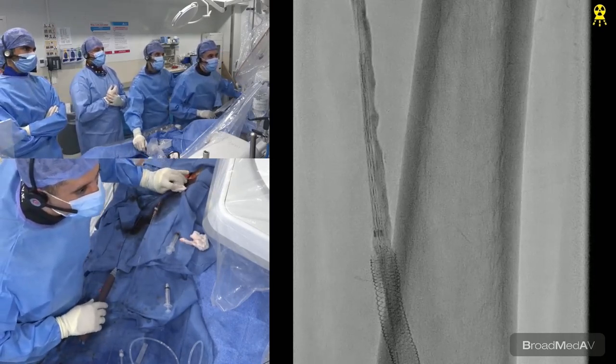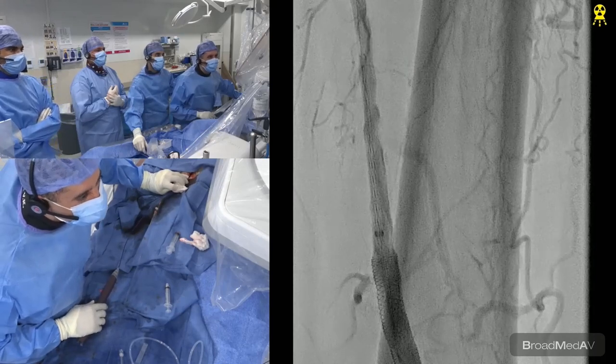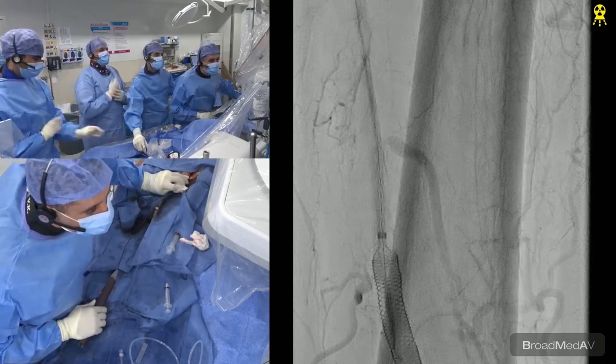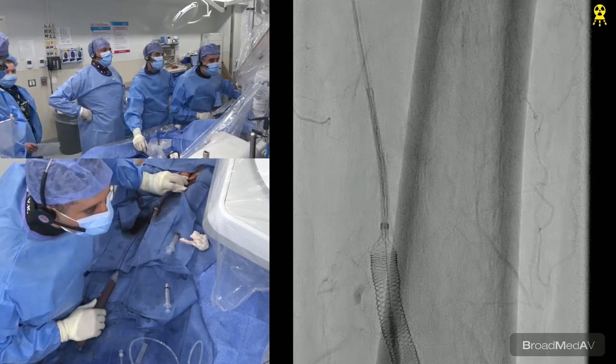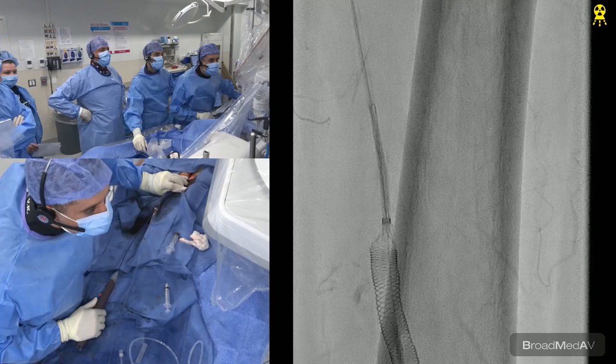Now you have to give him some diuretic. Yeah. So now he's coming to the end, so we need to see where it is. That's the part that we have to do, and I think that's good. Yep, you got to come down. You got to stack more. Yeah. You see that at that collateral. You're fine. Just keep, that's it.